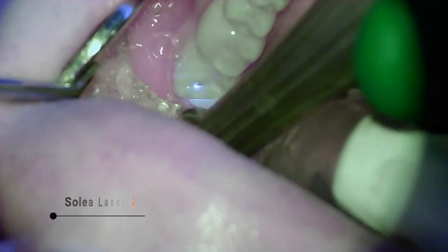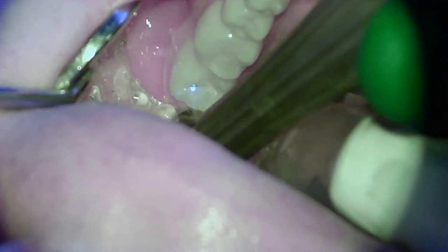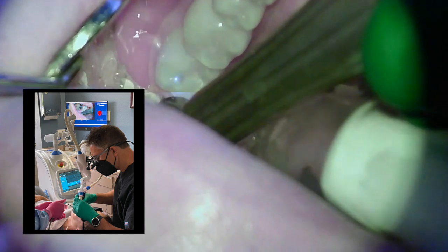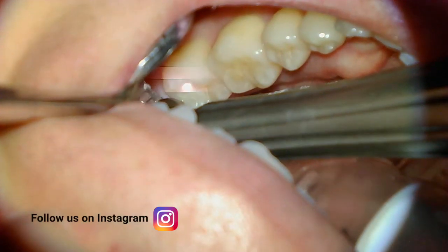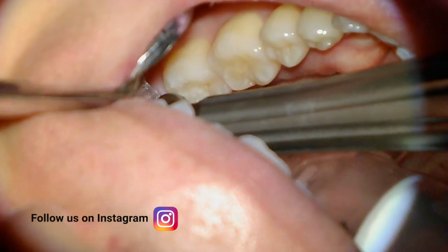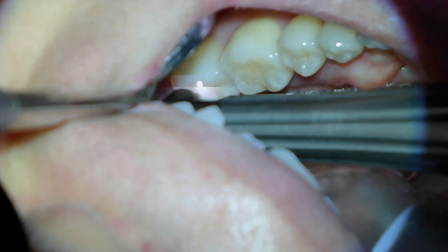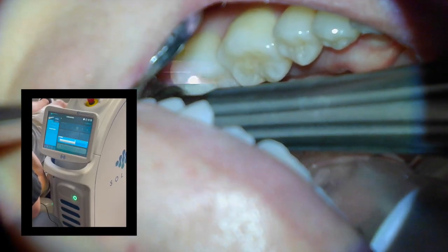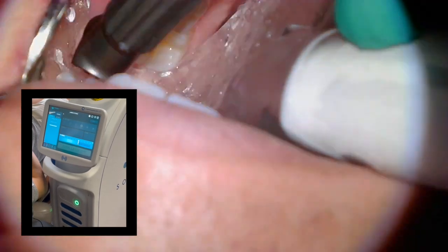Now we're going to start seeing the CO2 Solea laser in action, and here's just a quick picture of Dr. Angulo using it and recording some procedure videos. The Solea is an all-tissue laser, so we can use it for things like gingivectomy, but also in this case for caries removal. What it's doing is vaporizing the enamel to finish excavating the decay.